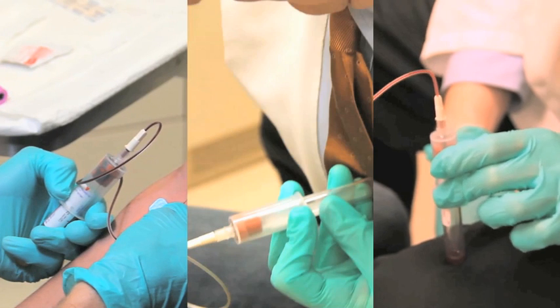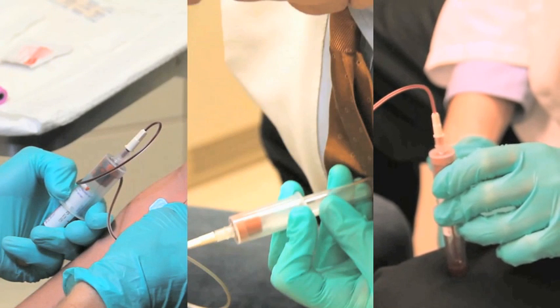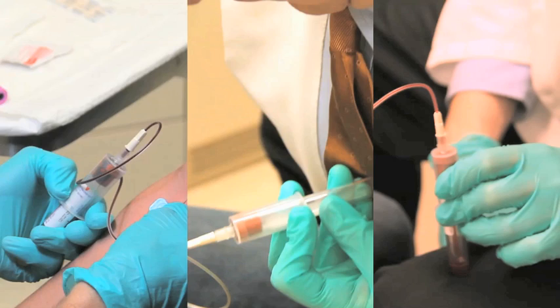Finally, you can press the vacutainer adapter on the vacutainer tube perpendicularly on a stable surface near the patient.